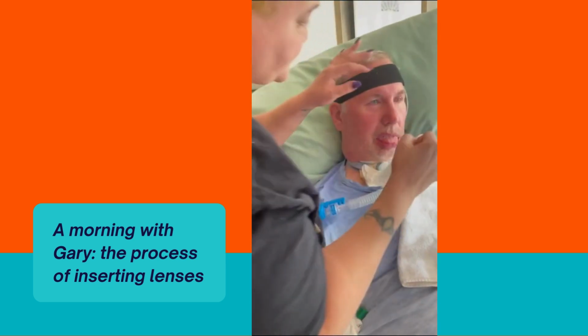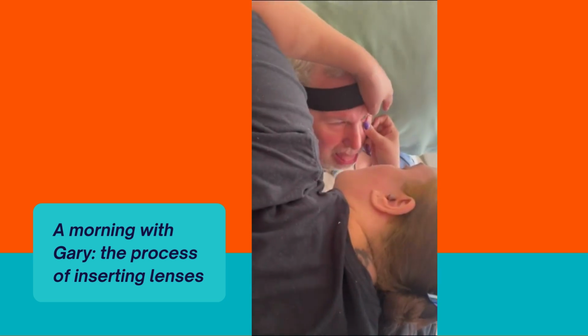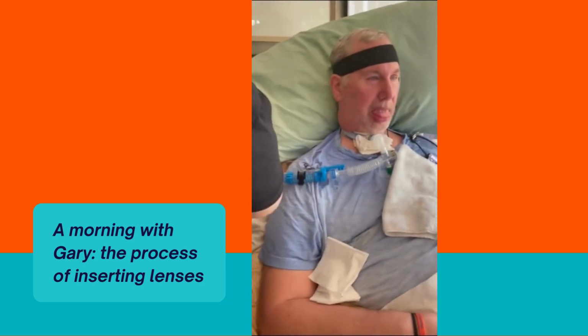Okay. It's a little harder to see that. But you want the two dots straight up, at like 12 o'clock on a clock. Correct. So she's going to now look in that eye and see how we're doing. See if she's got any bubbles. Any bubbles, dear? Looking pretty good? No, we're good. No bubbles.